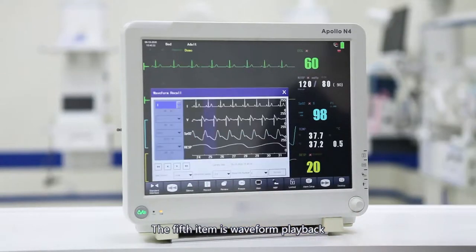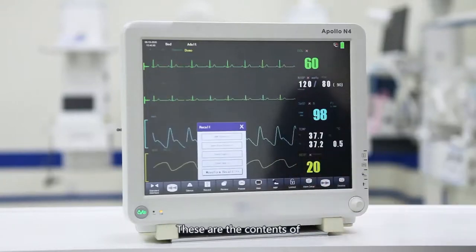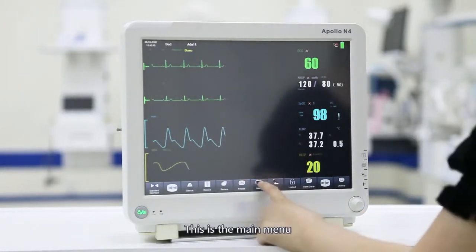The fifth item is the waveform playback, which includes ECG waveform, blood oxygen waveform, and respiration waveform. These are the contents of the information review. This is the graphic interface and this is the main menu.